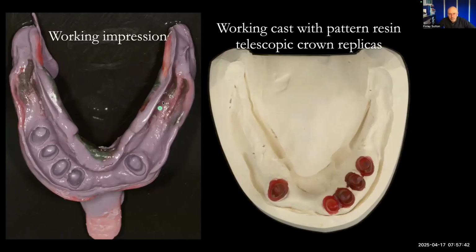You can see where I've pressed so that the saddle I've actually pushed down, so the green stick's pushed right through, so it's really well supported by that distal free end saddle here. This is an important point.